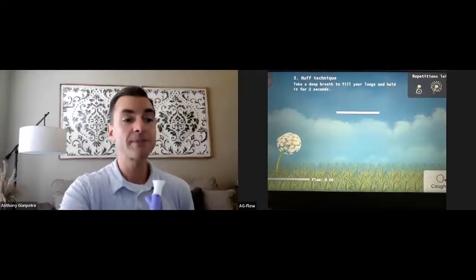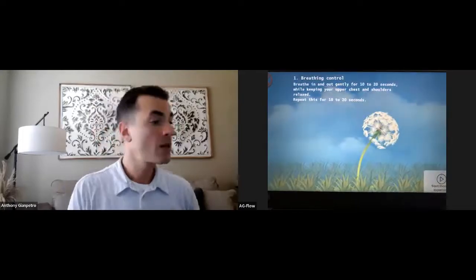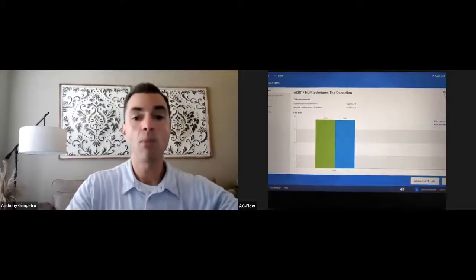Let's say I coughed. I cleared my airway. We're done with this activity. Okay. Some people don't want to use it for that. You can just use it almost as an FEV1 if you'd like to, much like the prehistoric contest, as I mentioned. So I'll get out of here now, and I'm going to go back to my share.